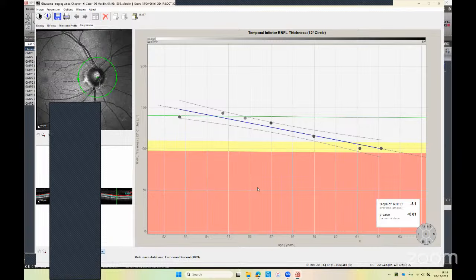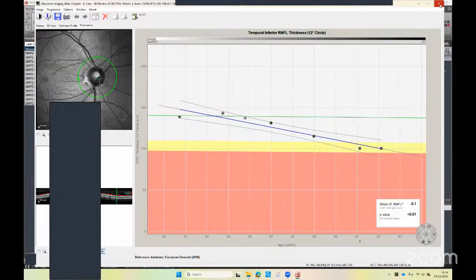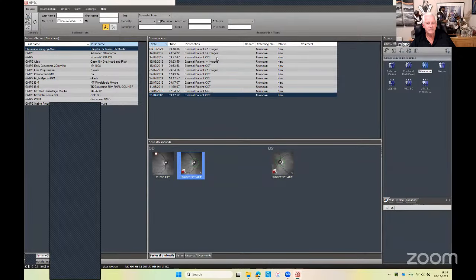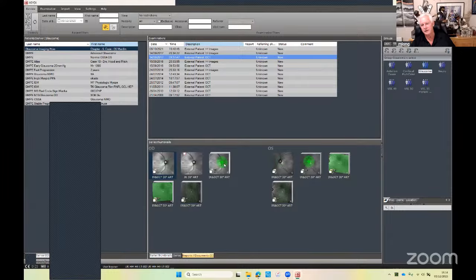At the progression in the optic disc and the RNFL area. Would you like to show some examples in MRW, in case you have one? Same patient, do you have something in the MRW? I think, let me just see, because I'm not sure if this patient towards the end started getting the MRW. Okay, so maybe we can have a look there.